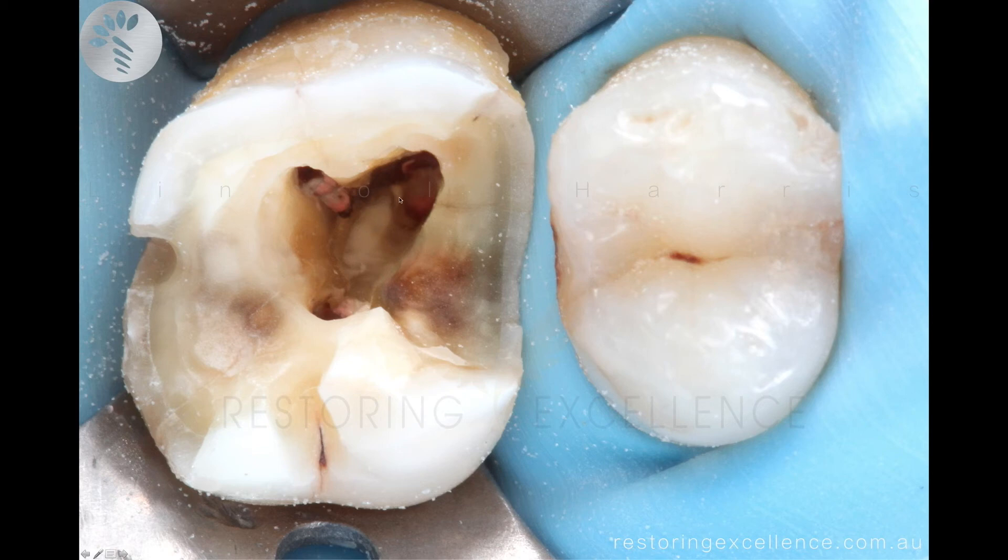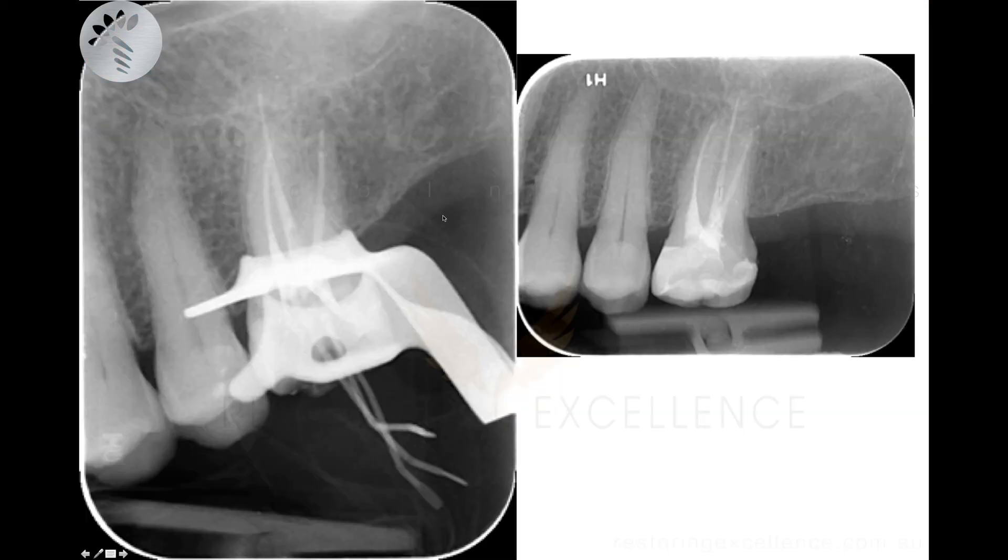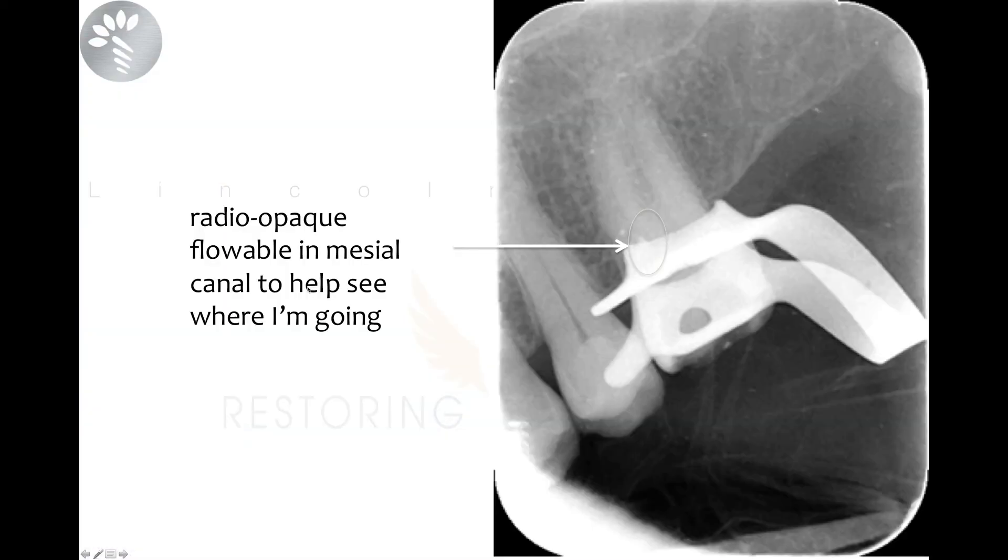Using that technique, I was eventually able to get to all the canals, even though it was a heavily sclerosed or calcified case. Sometimes putting a little bit of radio-opaque material into the canals can really help a lot when dealing with a calcified canal.